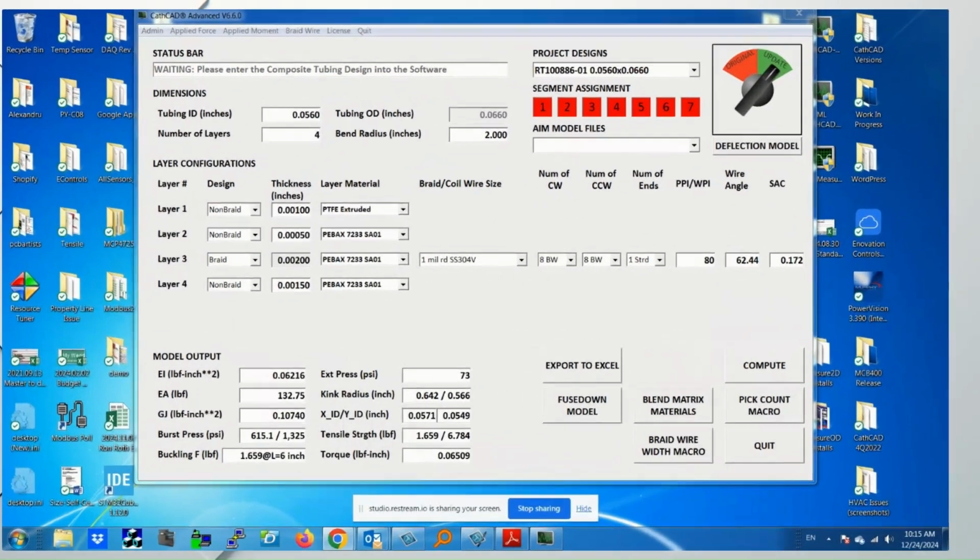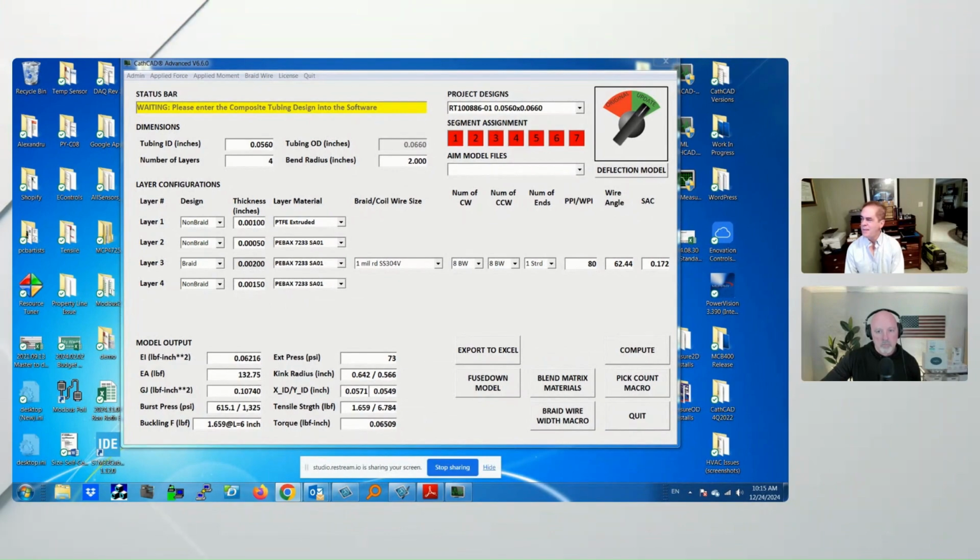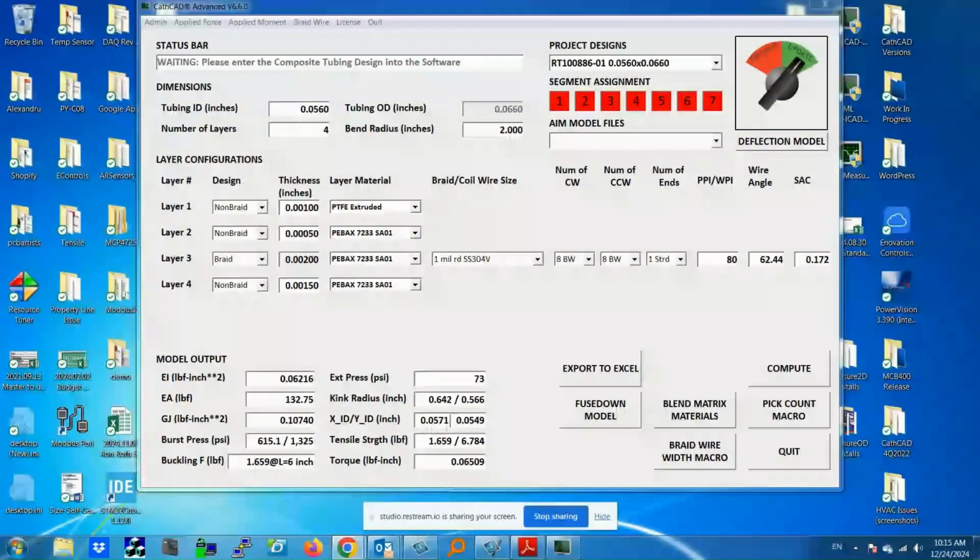Perfect. Thank you. So this is our CathCAD Advanced software. A license includes actually 3 software packages: CathCAD Standard, CathCAD Advanced, and we also have a multi-lumen software. They're all included. This shows basically about a 5 French OD guide catheter design. The ID is 0.056 inches. The inner liner is a PTFE extruded with a tie layer of PEBAX. We have a braid layer of a 1 mil round, 16 wires, basically done on a Steeger braider, typical 80 pick counts, and then an outer layer of PEBAX. So the wall total is about 5 mils.